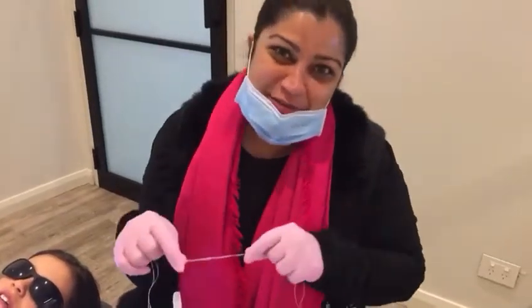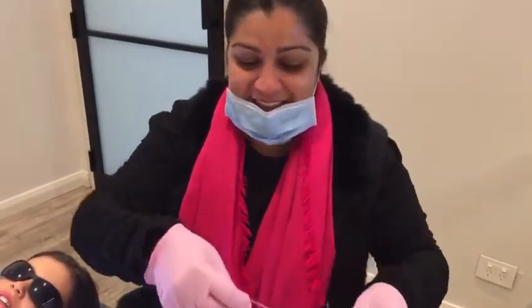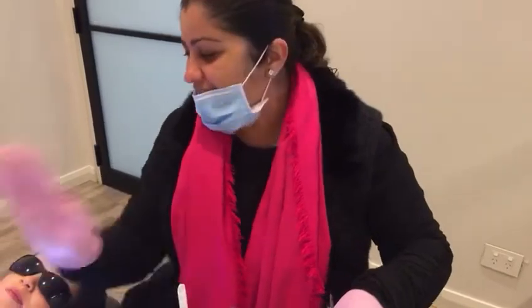Dr. Katyal, specialist orthodontist from CCC Smiles, and today we have Daisy here in the chair. Daisy can say hi. And we're going to put an expander for Daisy with two bands on 16 and 26.